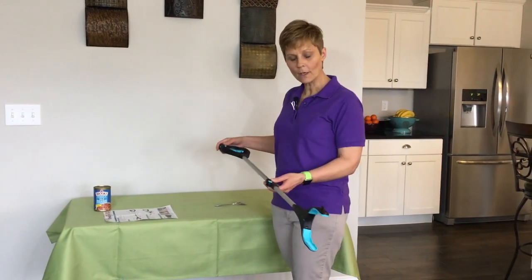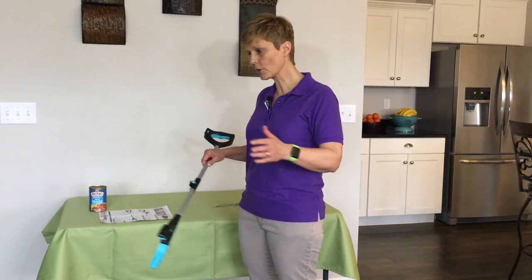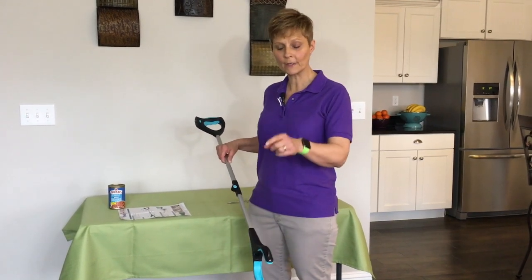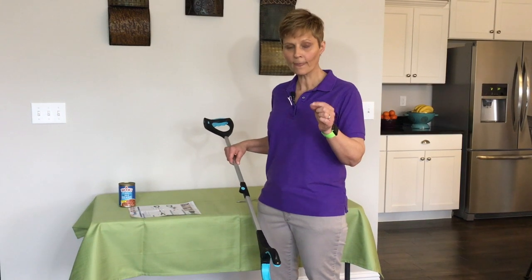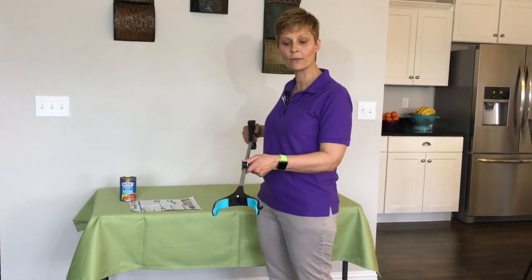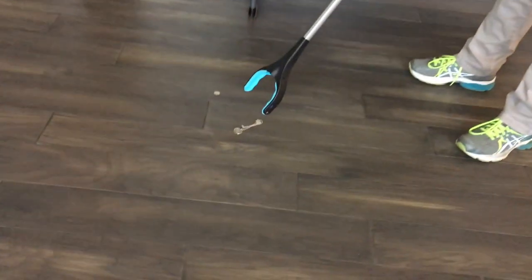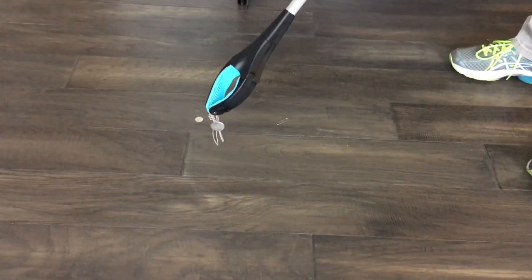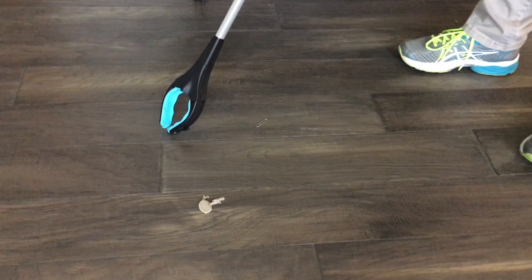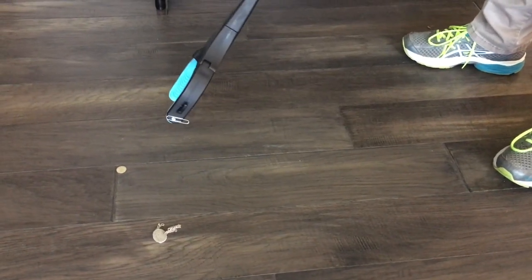The other thing I want to demonstrate is that some of the advertisements say this little hook can pick up a necklace off the floor. I did try that — I'm not going to show you because it was quite cumbersome. I was able to get a necklace up off the floor after multiple tries on carpet, but the necklace had to be looped and clasped. I was not able to pick it up with the hook off of the wood floor, but I did find I could pick a necklace up with the grabber arms themselves. I also have a dime here on the floor — I can pick that up with the grabber as well. And the magnet works very well to pick up a paper clip off the floor.